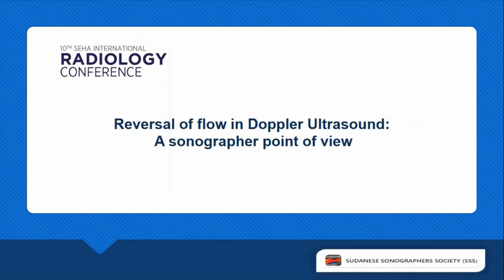Today, I would like to speak about the reversal of flow in Doppler ultrasound from a sonographer point of view.